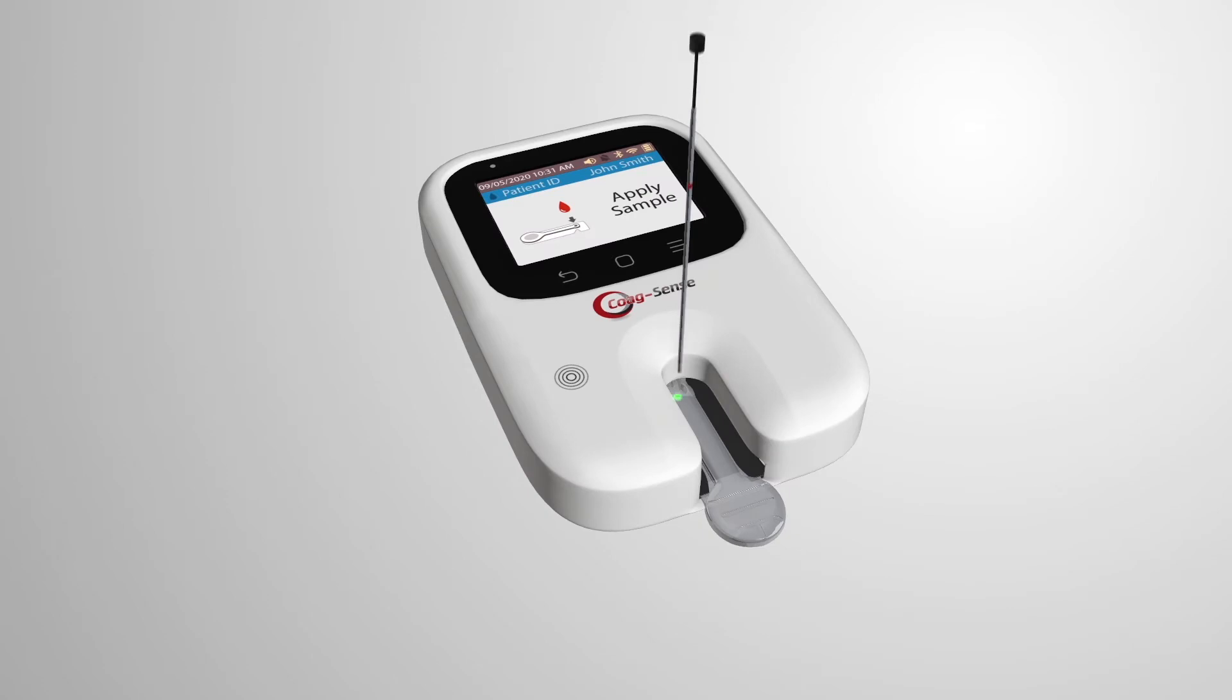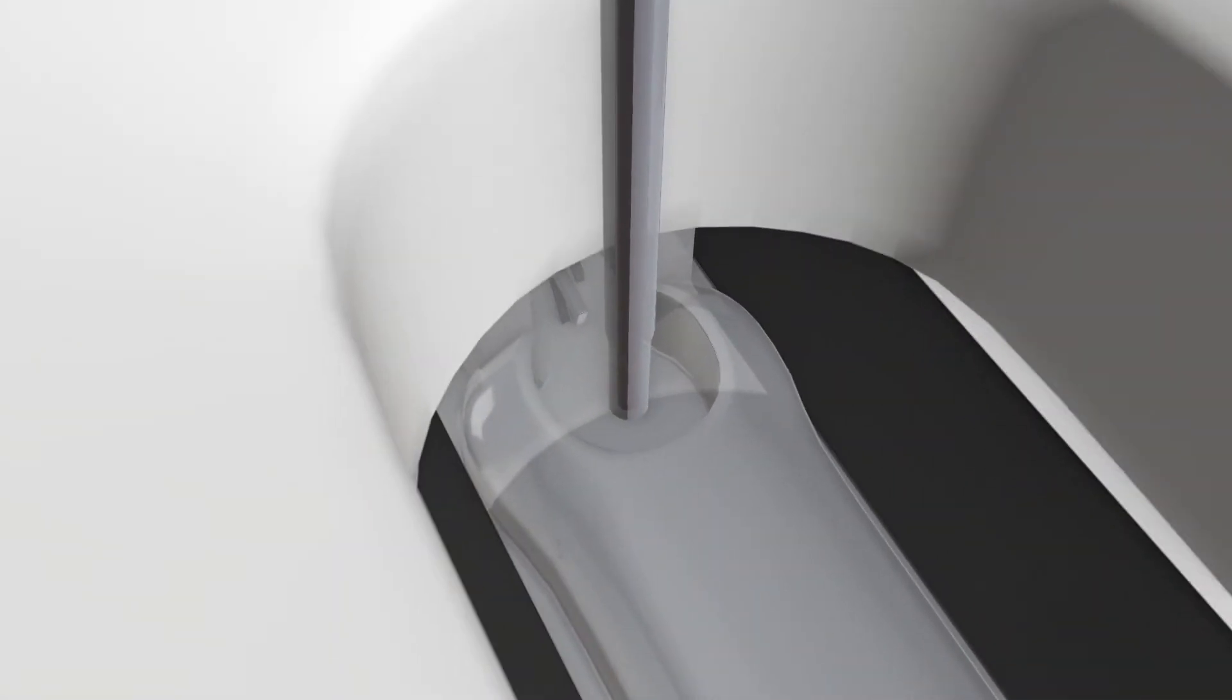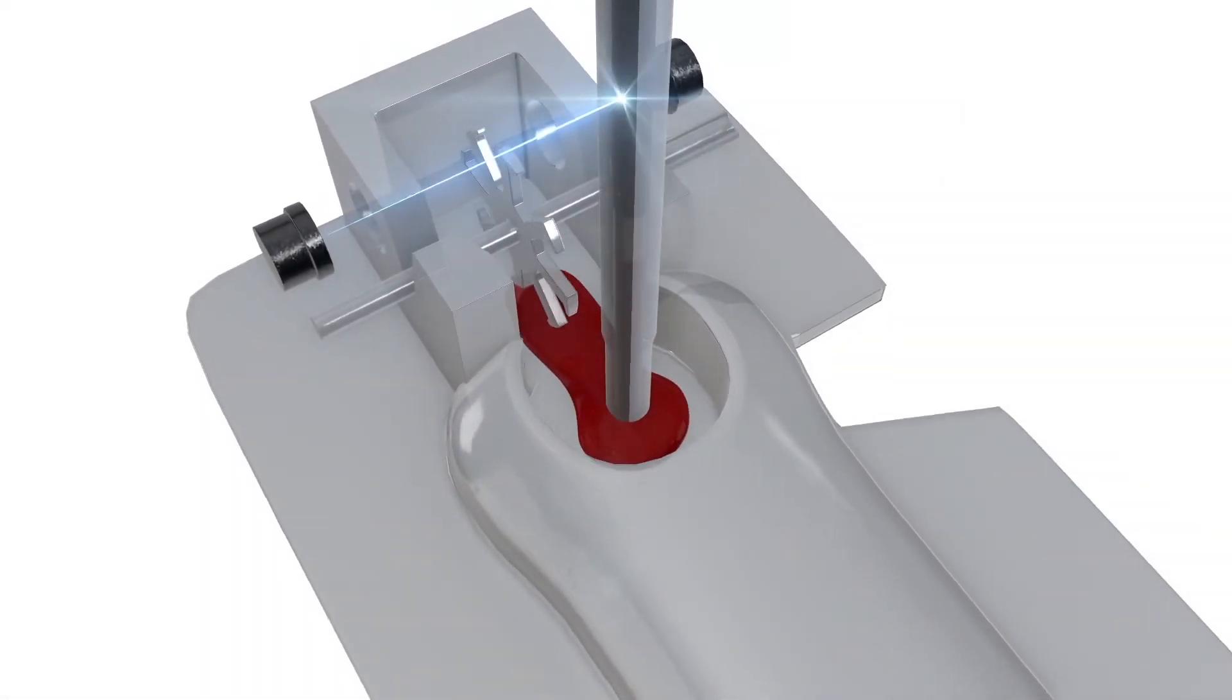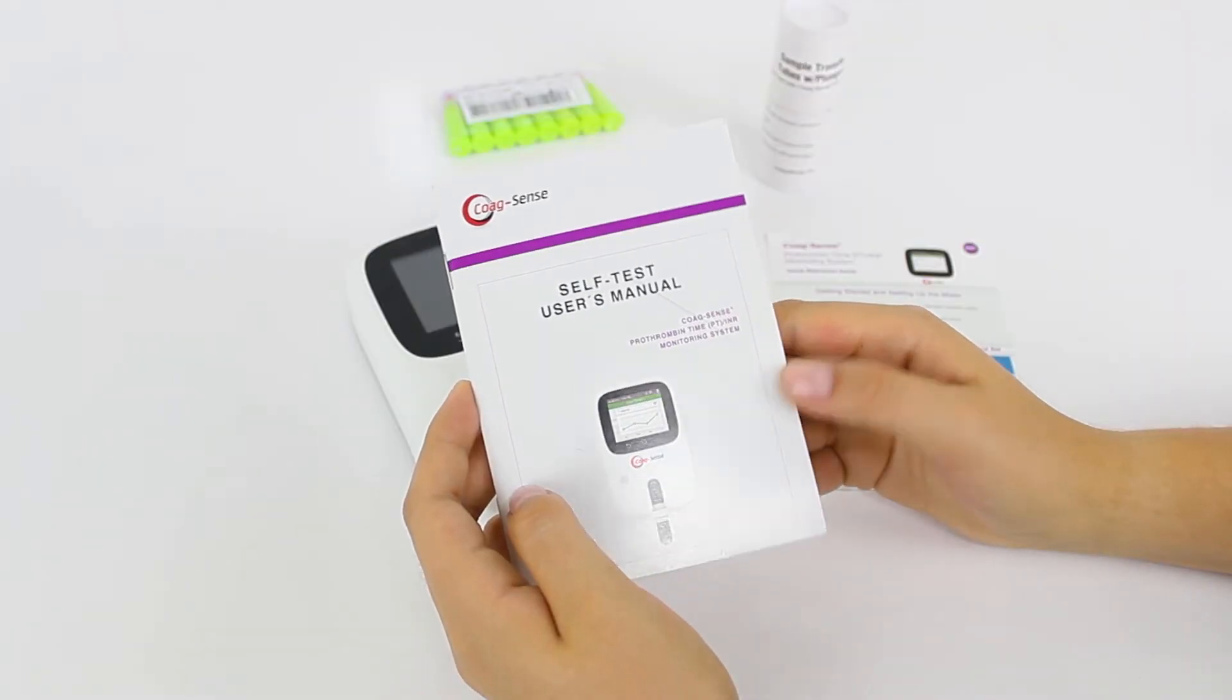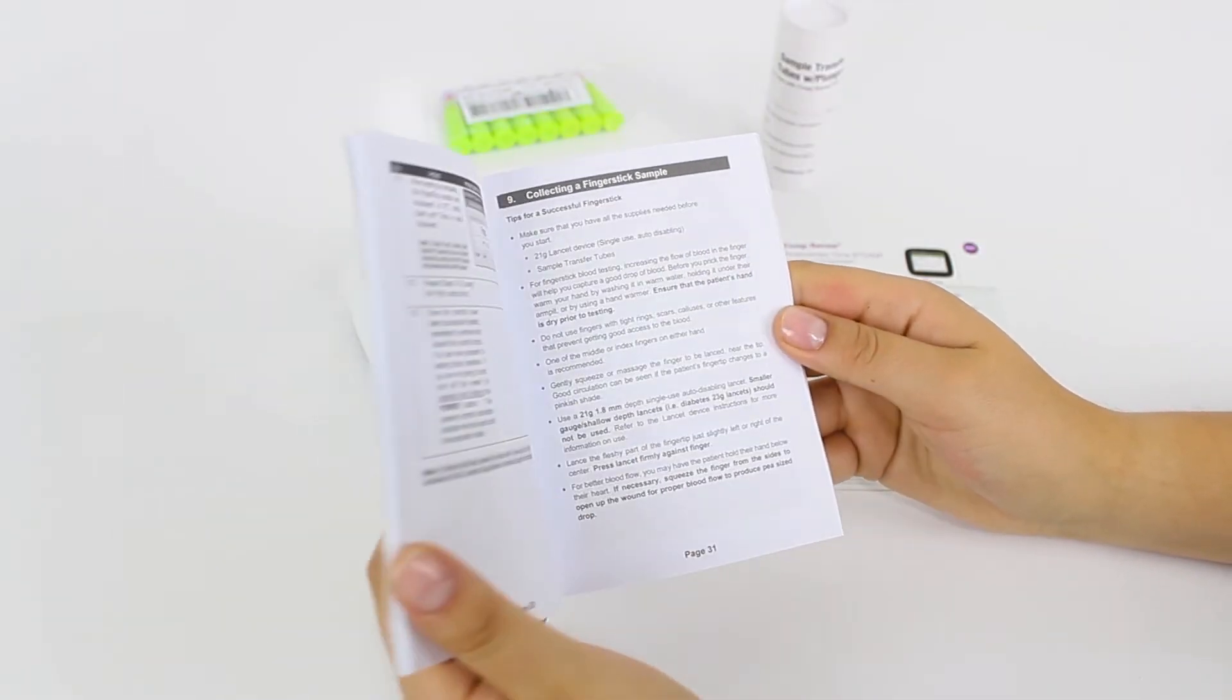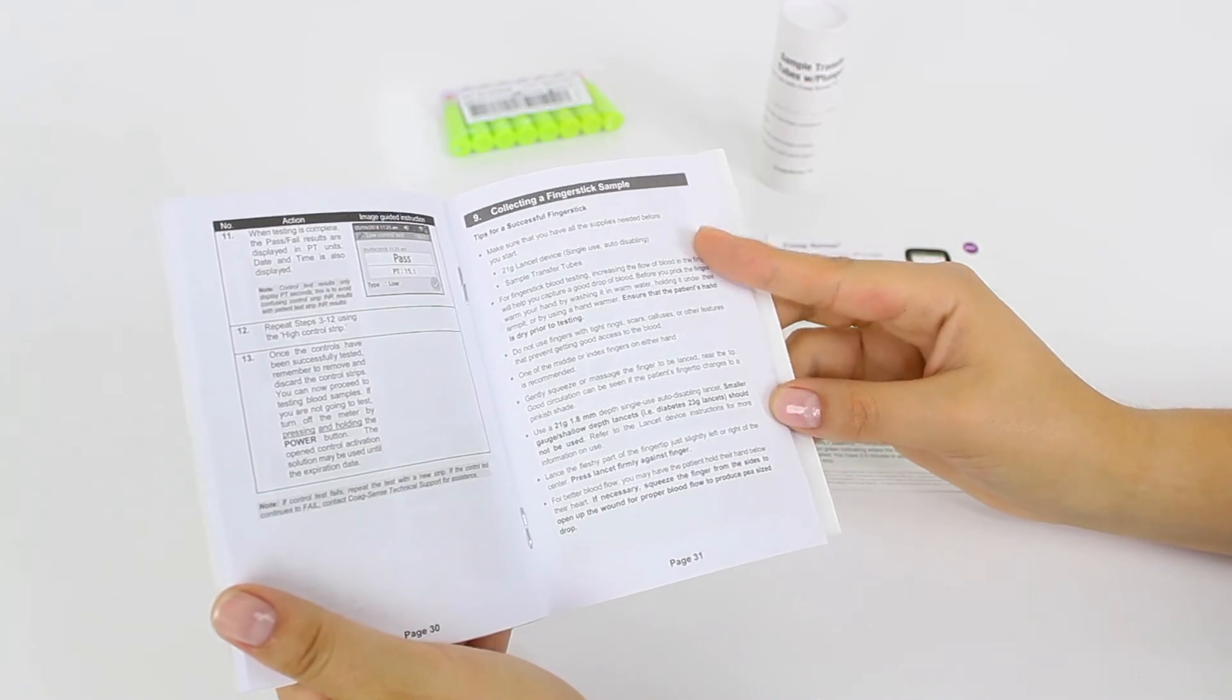This video provides a brief overview of how to perform a PT INR self-test. Be sure to read your entire user's manual carefully before you use your system.